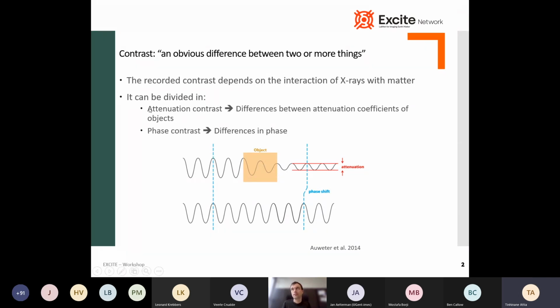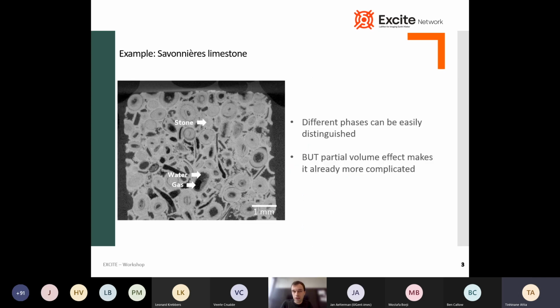And if this difference is big enough, we'll be able to distinguish two objects from each other or to see two phases within one object. You can also have a phase contrast, which results from the difference in phase, but here we will mainly focus on the attenuation contrast. So when you have a sample which has very big differences in composition and density, you can easily see the different phases, as I've shown here in this example from Savonnières limestone.